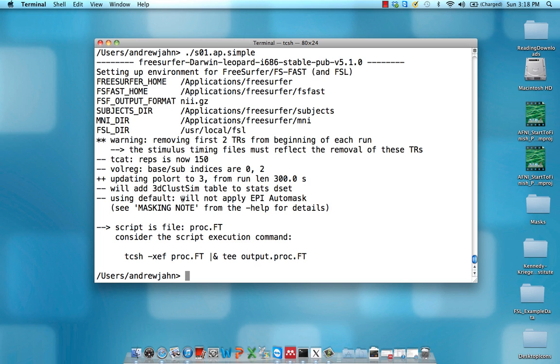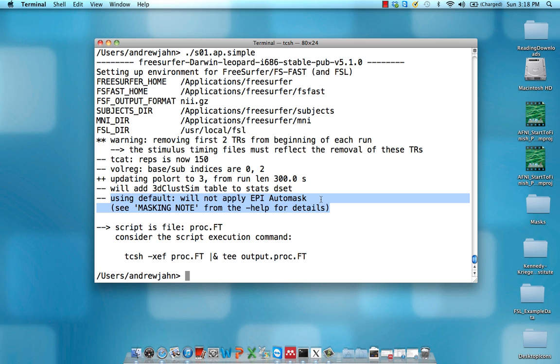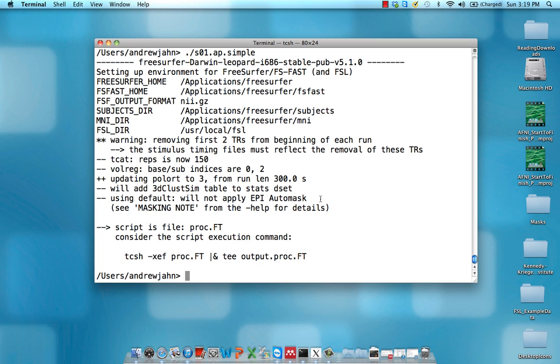We'll add 3D ClustSim table, we'll worry about that later. This just means it's using a default, will not apply EPI auto mask to the data. This is just a change from previous incarnations of AFNI_proc.py in that we're not going to do any masking or excluding any voxels until we get to a group level analysis, which will probably be in some sort of normalized space.